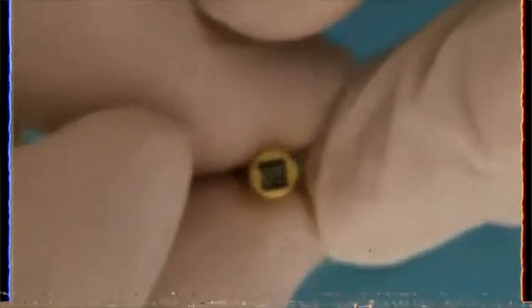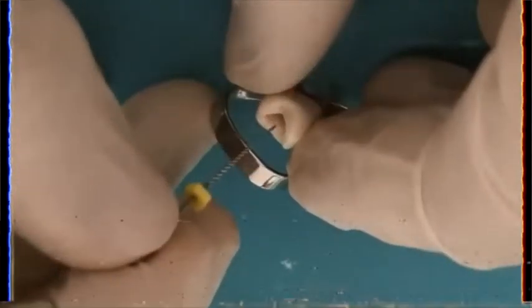Reaching now to our master apical file, which is size 50. We will now do the final circumferential filing, final tapering of the canal, and also check for the apical constriction.